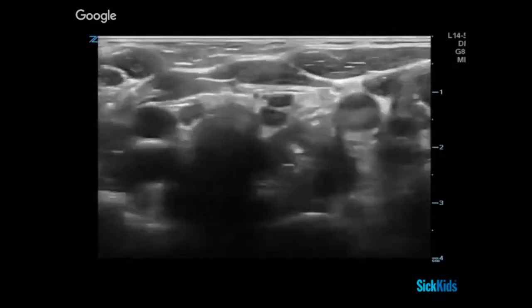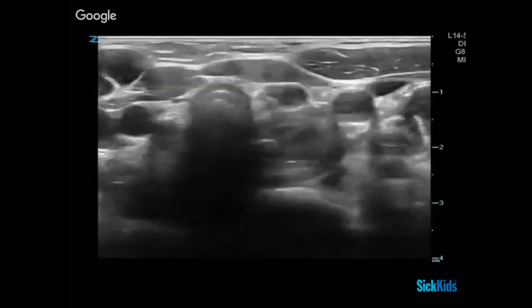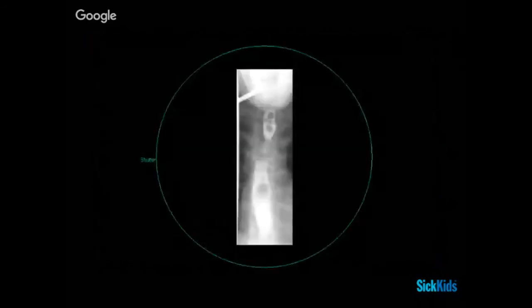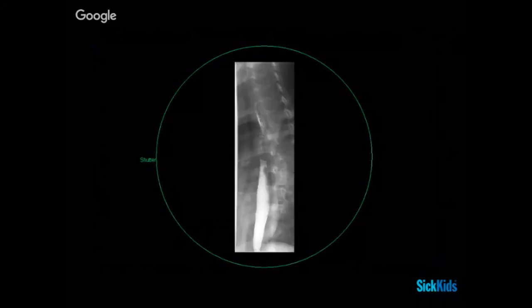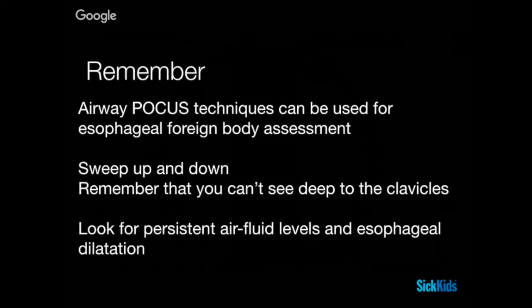Given this presentation and the history, we called ENT, who requested a barium swallow. Similar to our ultrasound, what we can see is a plastic coin nicely lodged in the esophagus. Remember: airway ultrasound techniques can be used for esophageal foreign body assessment. Sweep up and down, but remember you won't be able to visualize deep to the clavicles. Look for persistent air-fluid levels and esophageal dilatation as signs of an upper esophageal obstruction.